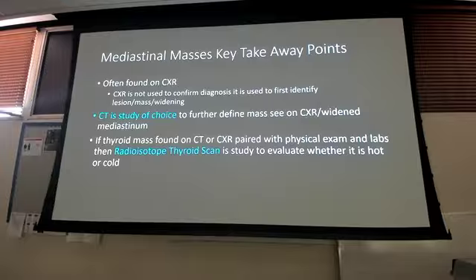You need to further evaluate from the CT, right? Unless it's a thyroid mass, well, you're still going to get the CT, but if it's a thyroid mass on CT, then you jump to either a radioisotope thyroid scan or thyroid scintigraphy, same concept, to further evaluate that goiter and that thyroid mass. Every other mass, the CT is pretty much going to get you what you need to know and determine whether or not you need a biopsy. But the thyroid one, you take that next step, if it's confirmed that it's a thyroid, to figure out cold versus hot, that kind of thing.